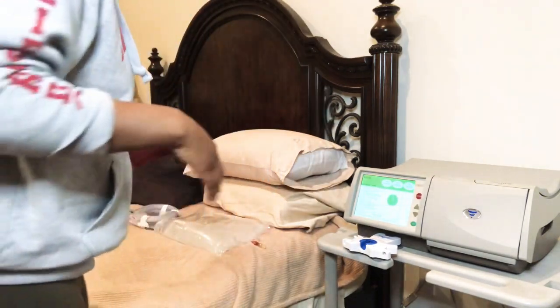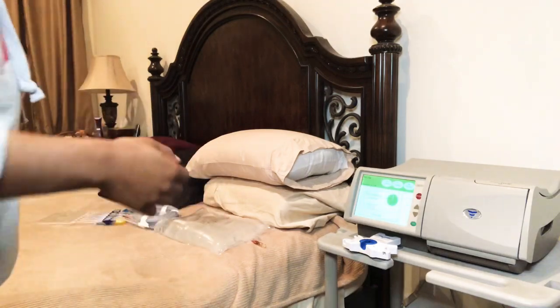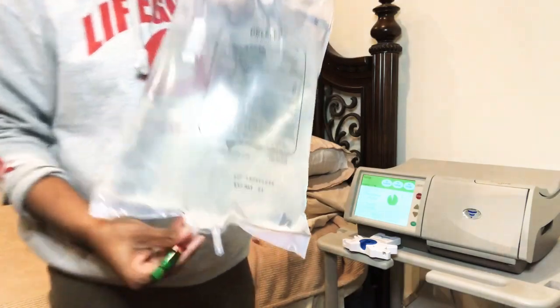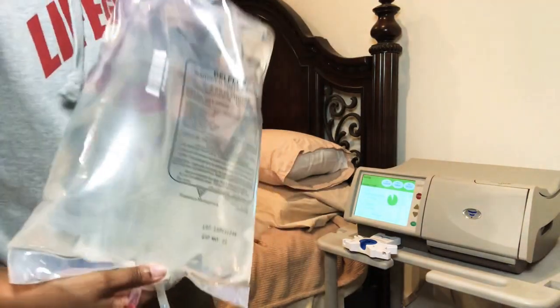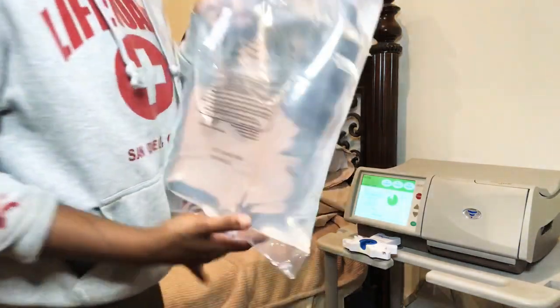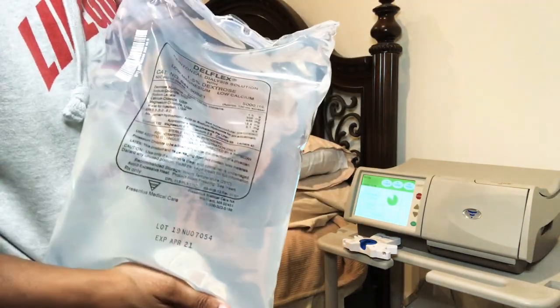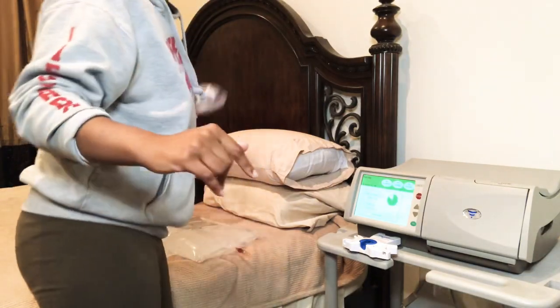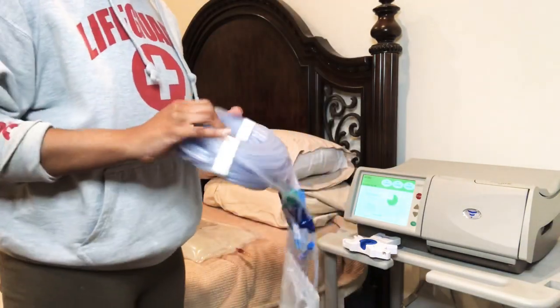So usually I did skip a step here. I'll go ahead and get my supplies out, which they're already out. I have 2 bags. I have one green, which is a 2.5 dextrose solution. And then I have a 1.5. The 1.5 is not as strong as the 2.5, the green, and I never use a red.